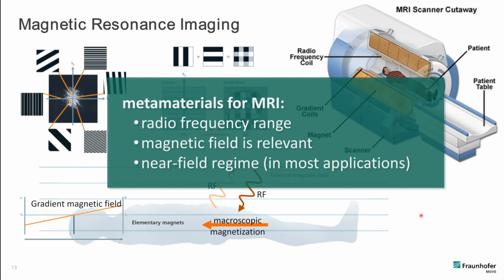We are building our metamaterials with mainly the magnetic field in mind and not designing how the electrical field behaves. But that's something I will also come back to later and mention again.